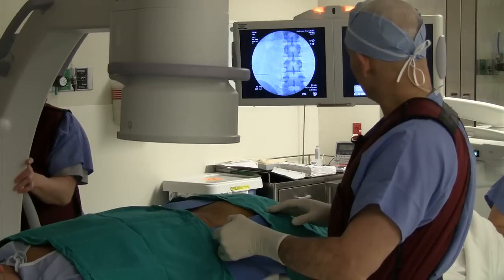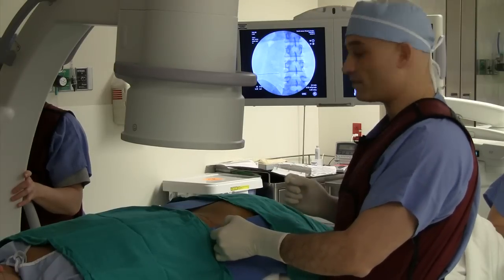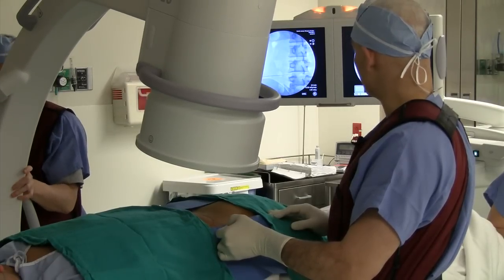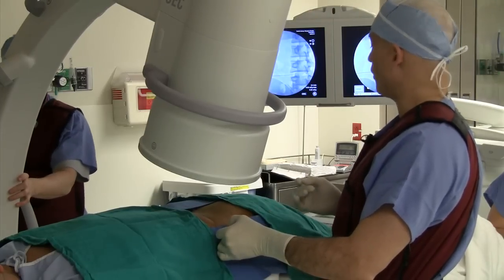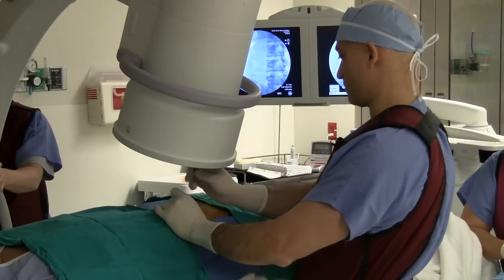I'm going to ask the X-ray technician to tilt the C-arm to obtain what we refer to as an oblique view. How many degrees is that? 15. Keep coming to 20, please. Stop there. We now have an oblique view of the neuroforaminal space, and I'm going to use this view to guide the needle into the correct position.